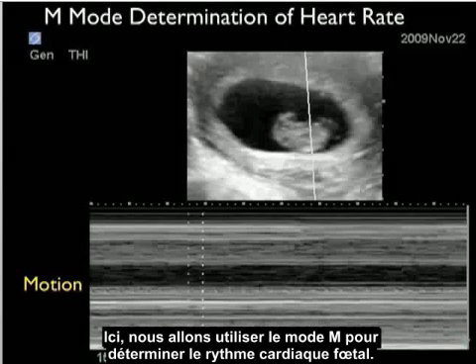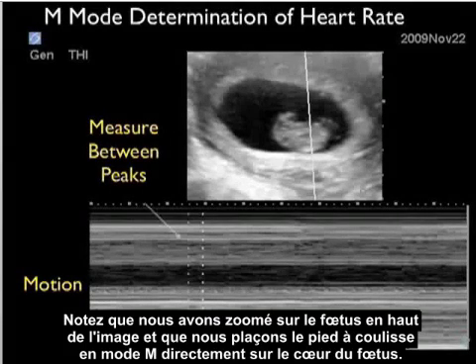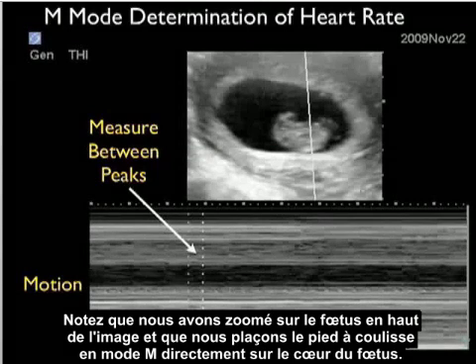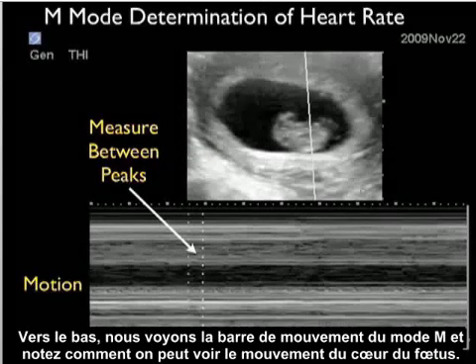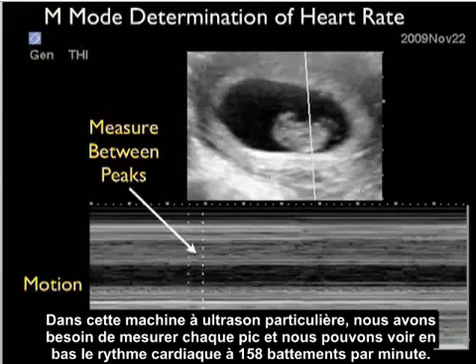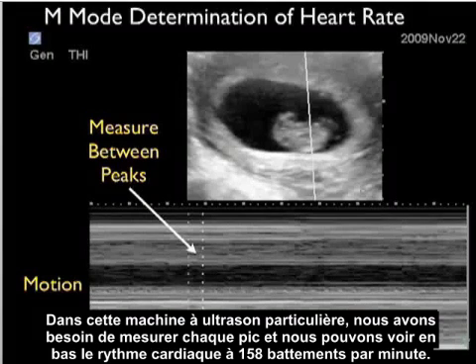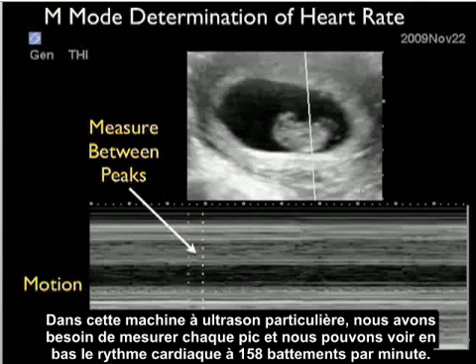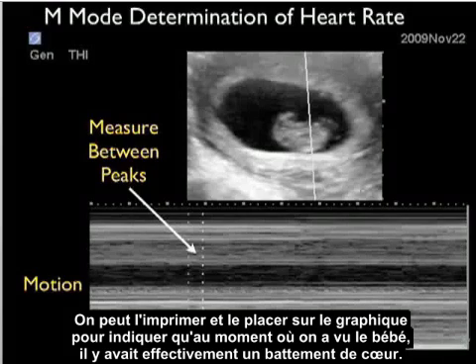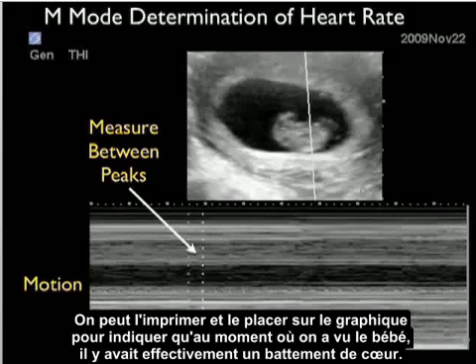Here we're going to use M mode to determine the fetal heart rate. Notice we have the fetus zoomed up towards the top of the image, and we're placing the M mode caliper directly over the fetal heart. Towards the bottom, we see the M mode motion strip, and notice the little waves showing the motion of the fetal heart. In this particular ultrasound machine, we need to measure between each peak, and we can see here that we get a heart rate determination towards the bottom — 158 beats per minute. This is something we can print out and place on the chart to show that at the time we saw the baby, there was an actual heartbeat.